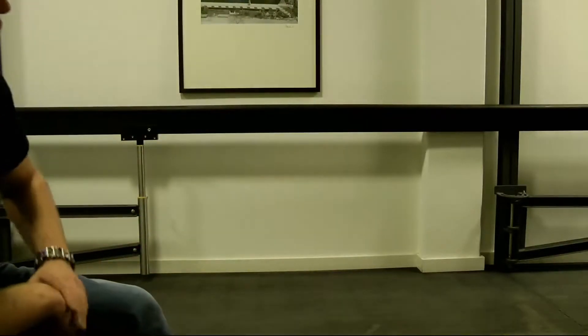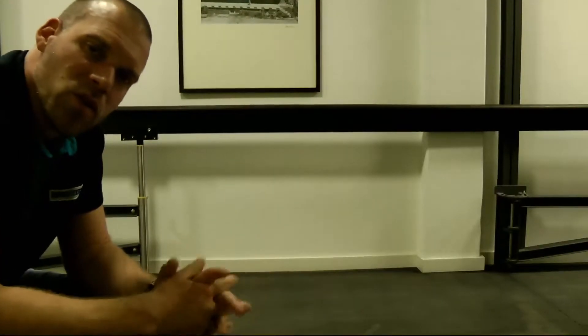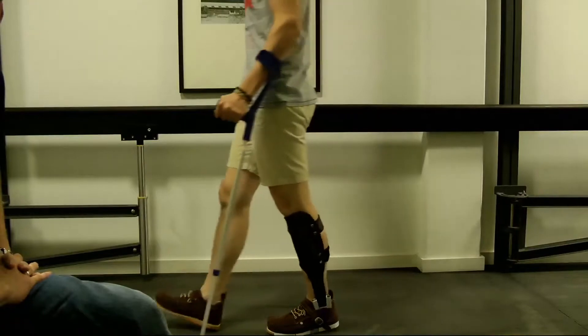If the patient feels insecure with the orthosis, it is of course acceptable and recommended that the patient chooses a suitable walking aid — in this case, forearm crutches — so that he is able to walk safely and get used to the new orthosis.